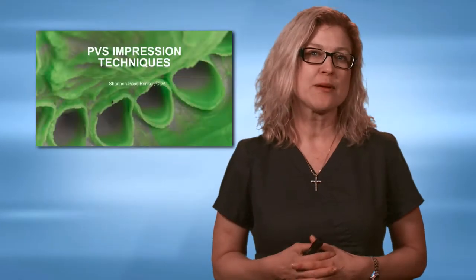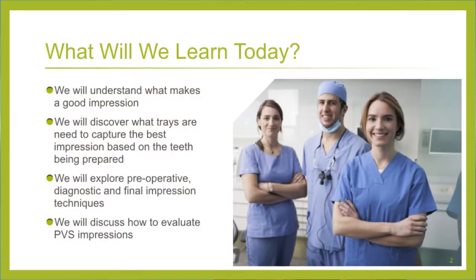Hi, I'm Shannon Pace-Brinker with the Academy of Chairside Assisting, and our module today is going to be PVS impression techniques. What are we going to learn today?